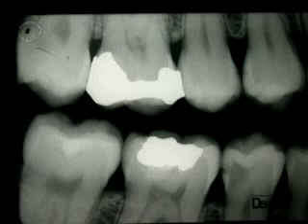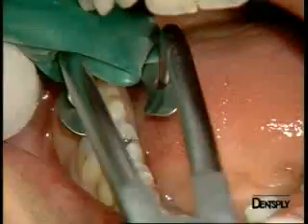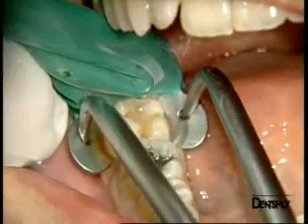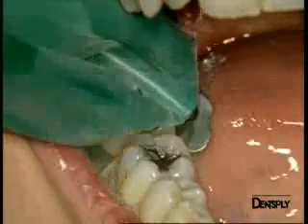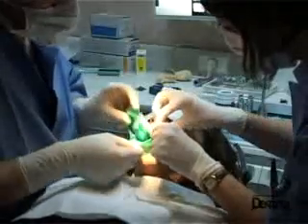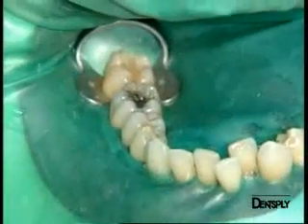This means we will have to remove the decayed dental tissue with care. After having performed the anesthesia, the rubber dam is put in place by setting a clamp on the last molar, tooth 7. It allows us to pull the rubber dam material correctly, and thus helps to create an acceptable free space for the restorative work.